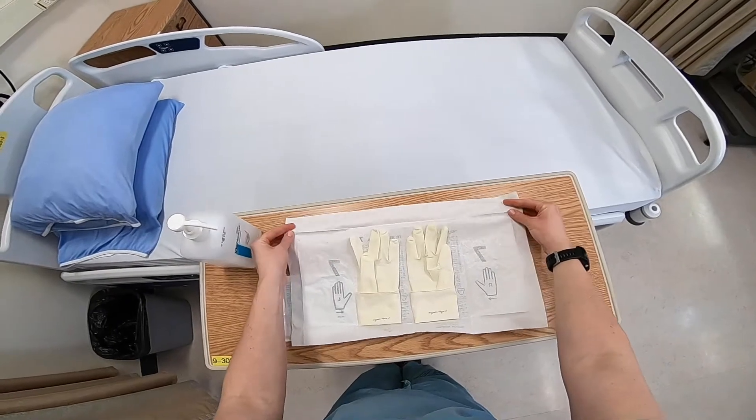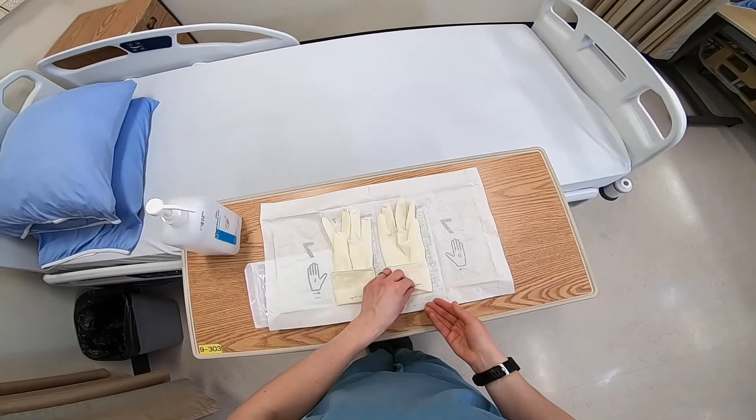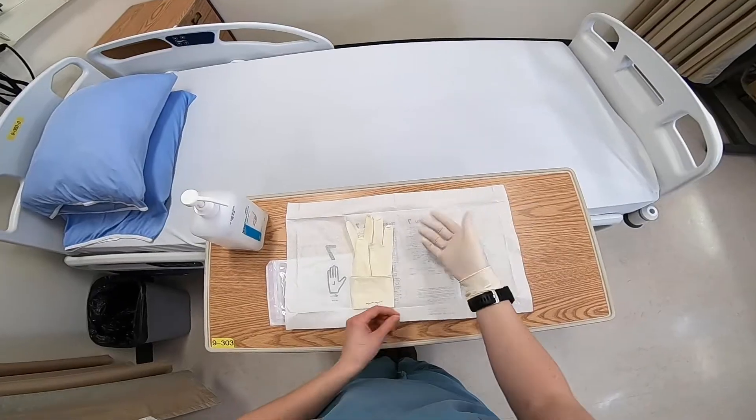Glove your dominant hand first. Pinch the inner surface of the cuff with your non-dominant hand and slip your dominant hand into the glove. Leave a cuff at the wrist.